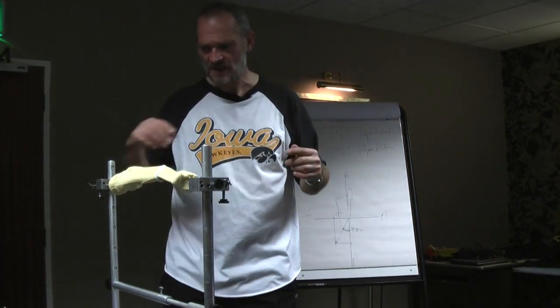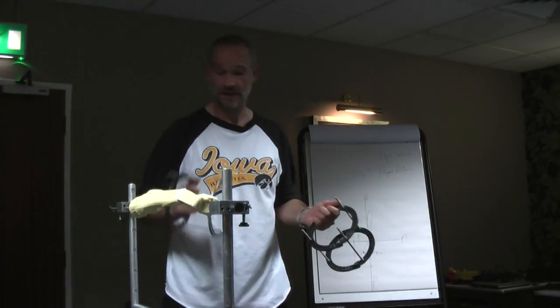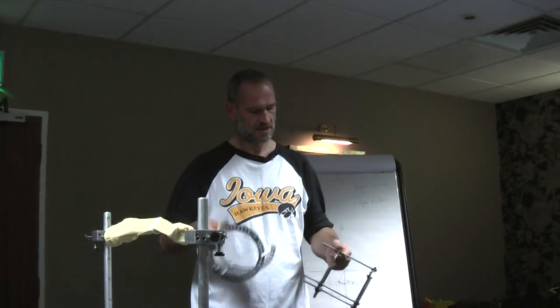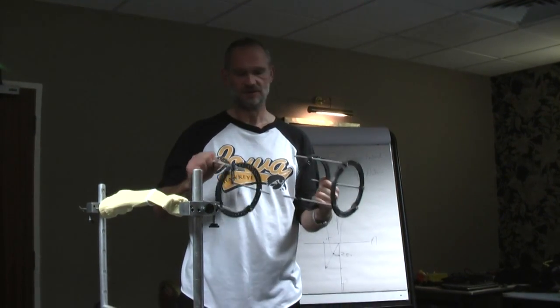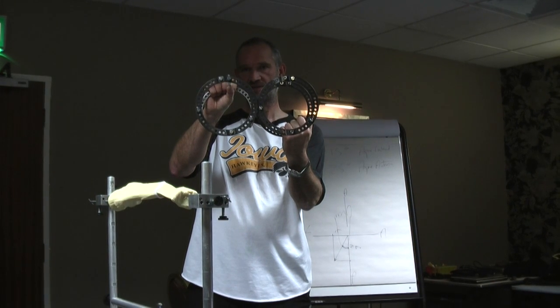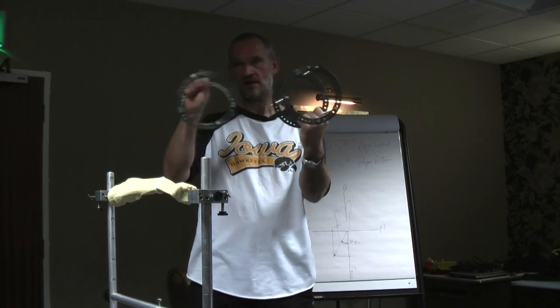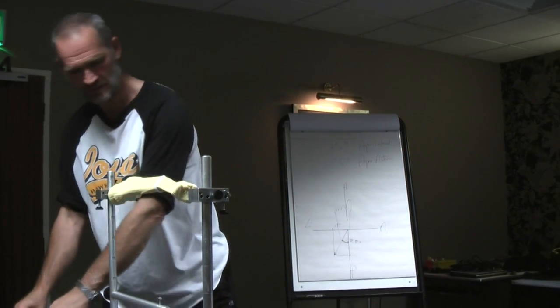All right? In the interests of speed and time, just because I want to talk to you through this and then let you get on with it, I've done a bit of pre-building. So there is a proximal ring couple, which is a ring and a 5/8 ring, and an identical distal couple, which is two rings. And one of the things you'll notice is if you look at where the rods are in the rings, they are evenly spaced. So same size rings with the rods in the same space. Okay? That works because it means you're not wasting holes in the ring on two separate rings when it comes to joining things together. Okay, so that's the first bit of pre-build we've done.